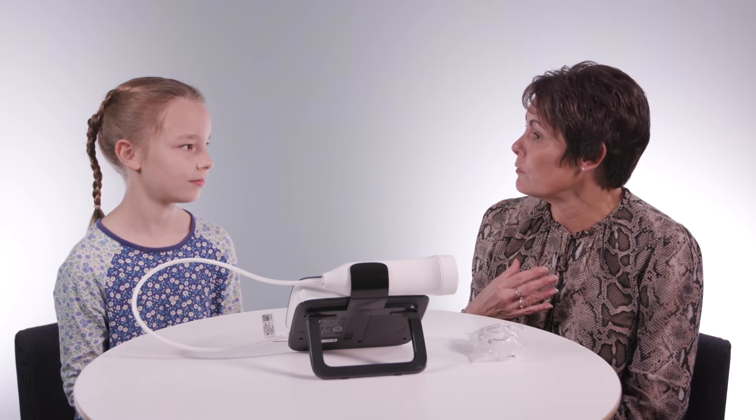Okay Charlotte, so now that I've asked you quite a lot of questions about your breathing, you've told me that you've got a cough and sometimes you wake up at night and sometimes the cough is a little bit troublesome when you're doing the dancing on a Saturday.